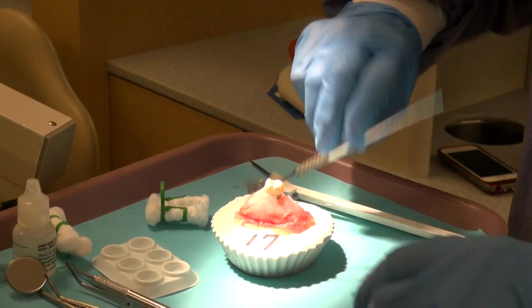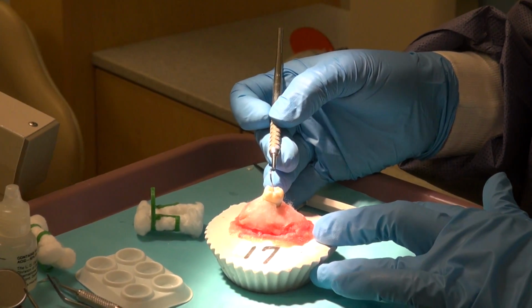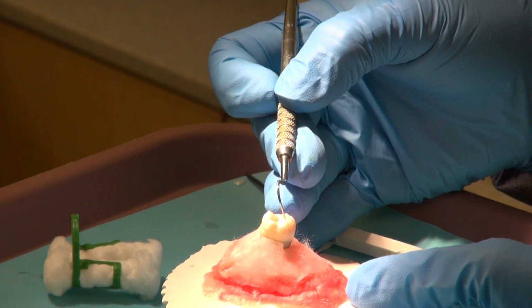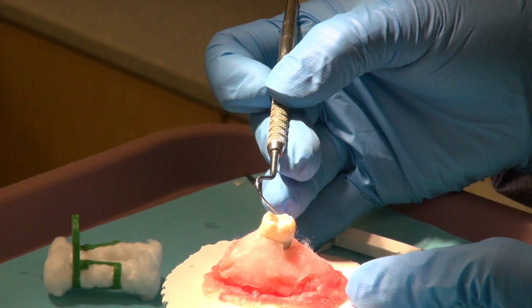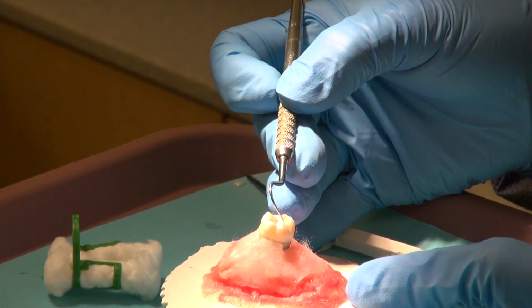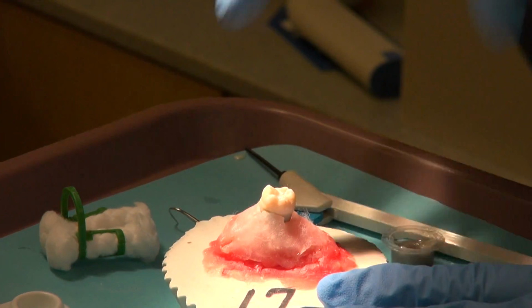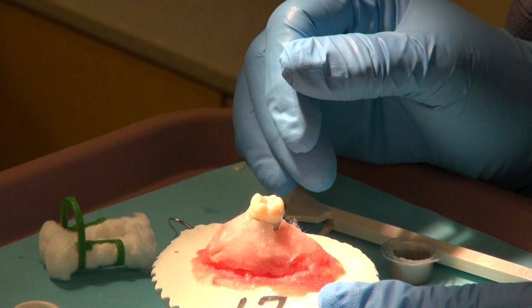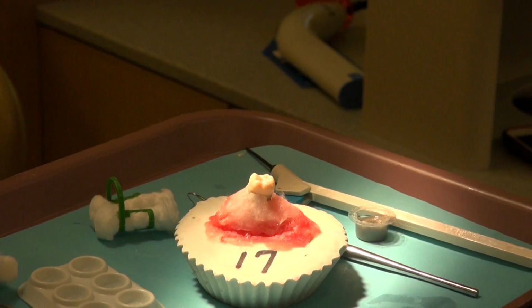Take our Explorer once again and take a nice feel. Make sure it's really slippery and hard, like glass. It feels like an ice skating rink. There's no soft material, it just is solid sealant. The next step would be to check our bite by articulating, making sure that this has no interference with the occlusion, and we're good to go. So we'll articulate and be finished.